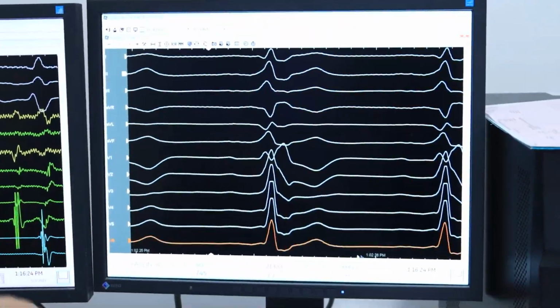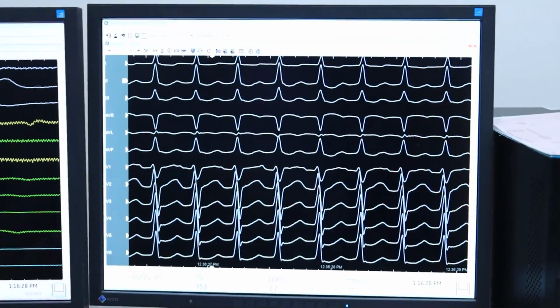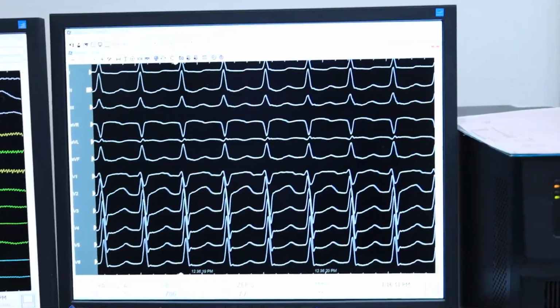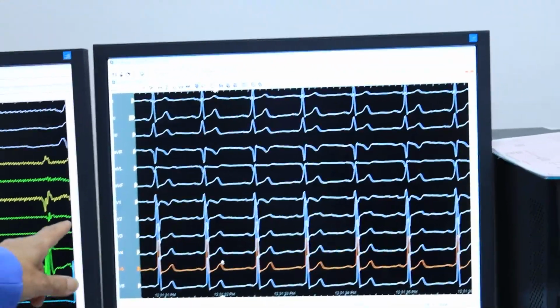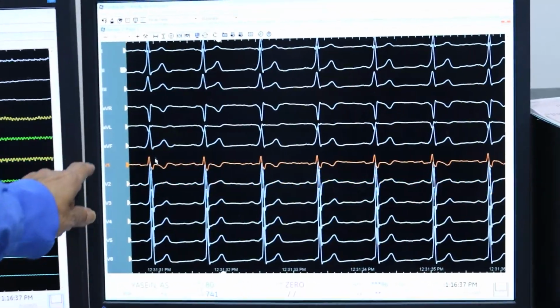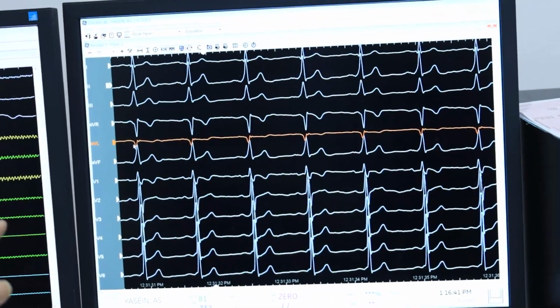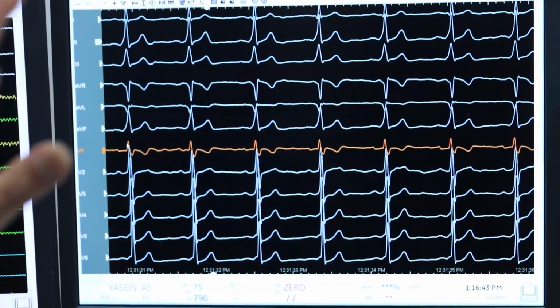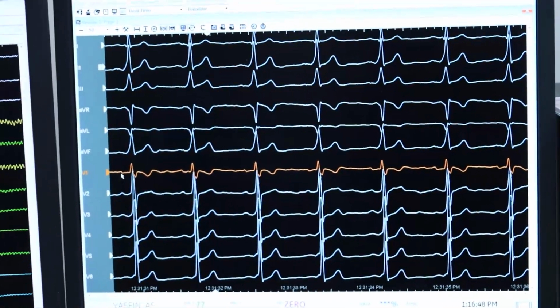During the study we placed the CS catheter from the inferior vena cava, and this is the resting ECG. Here we concentrated on AVL. Where is AVL? This is a negative delta. And in V1 there is an R wave. This does not show like this in anteroseptal. This is why I said we'll start with the EP study.